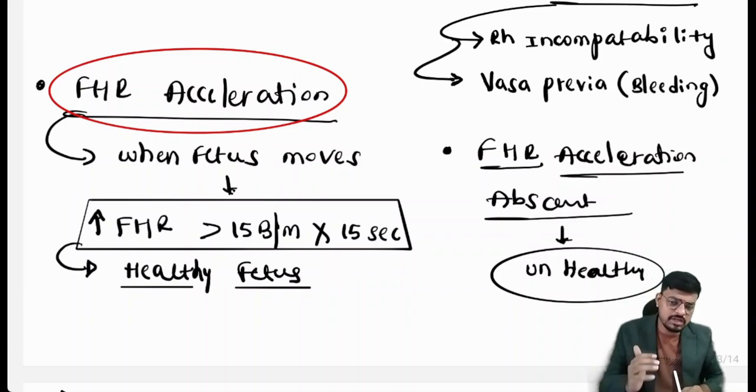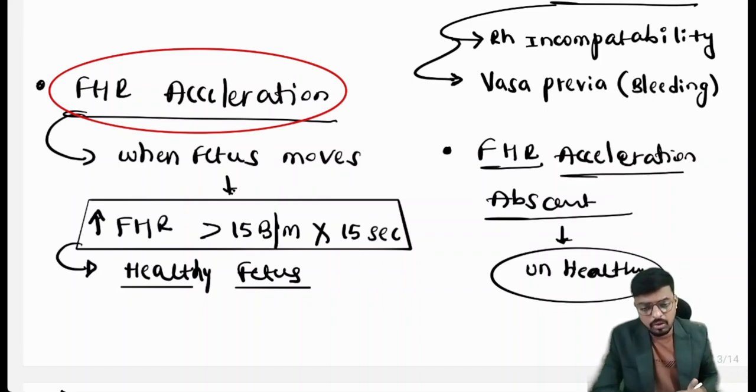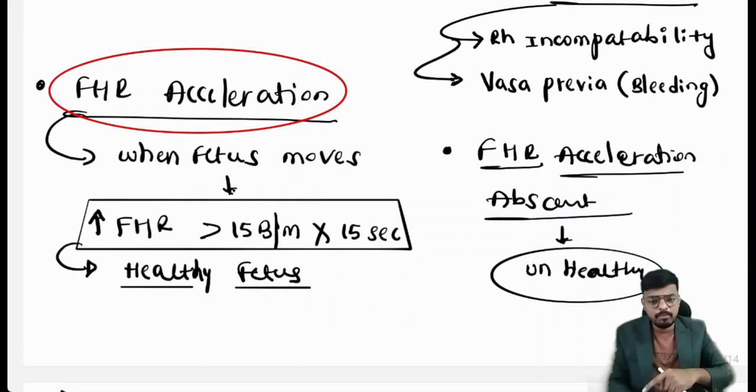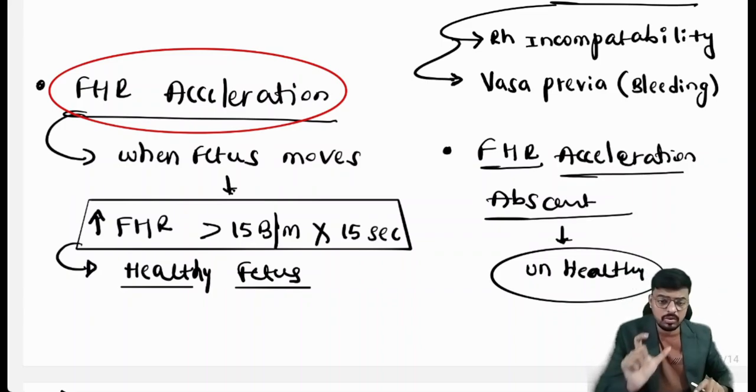Here the FHR acceleration means the fetal heart rate is increasing. When the fetus moves inside the mother's uterus, at that time the fetal heart rate increases by 15 beats per minute for 15 seconds. That is what we call the fetal heart rate acceleration. It must happen normally and should be present. Only then will we say the NST is normal, or reactive.